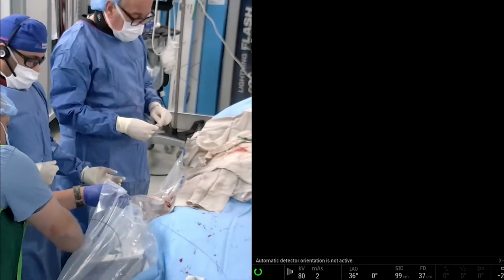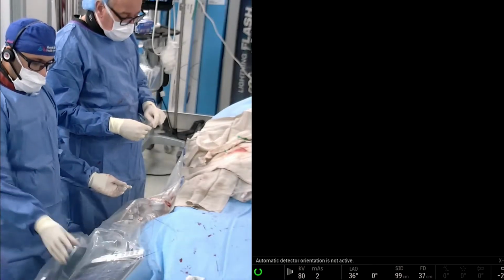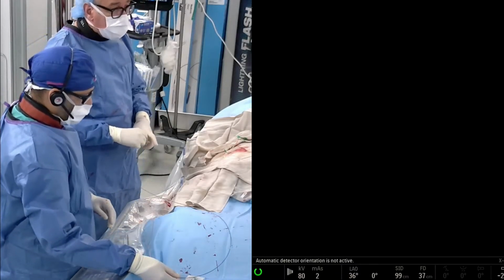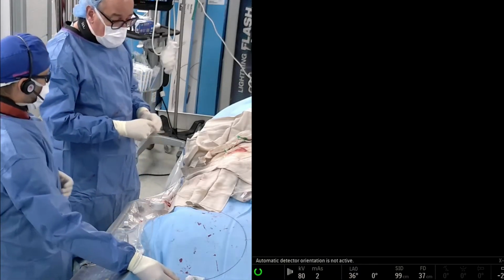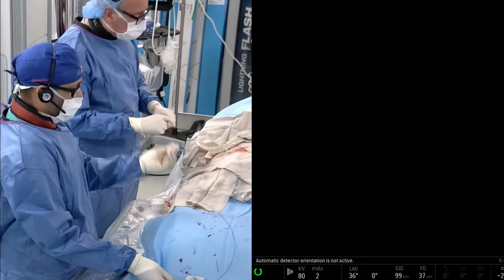Okay. Yeah, and I think the IVUS is really nice to just get true luminal diameters and also intraluminal calcific plaque and see what that's doing. I think that now we're in the era of scaffolds below the knee. I think it's absolutely imperative that you use intravascular ultrasound.